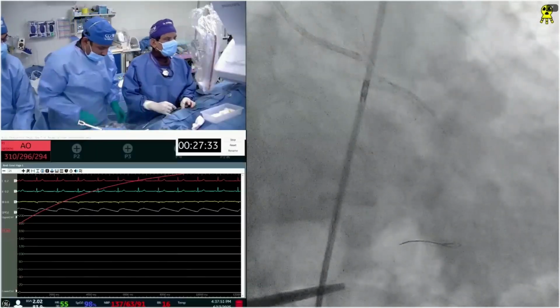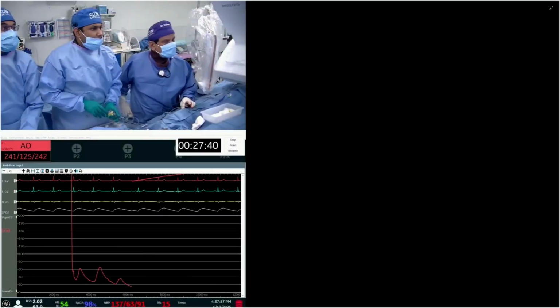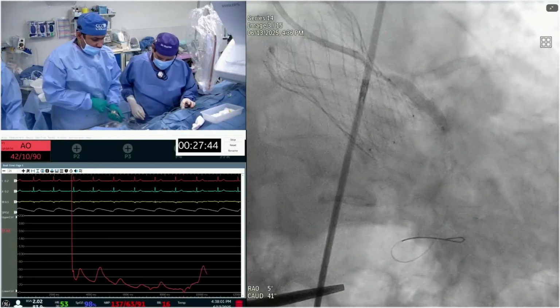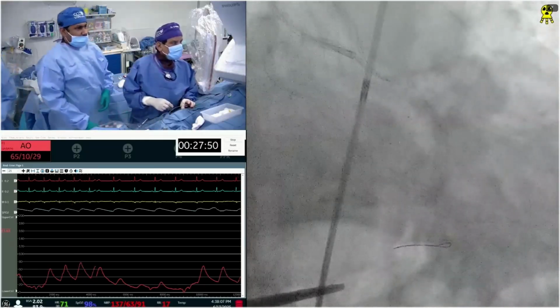Go up. 10, 12, 14, 14, negative. Look up 4.0, high pressure, 14, or 4.5 actually, 4.8 high pressure.